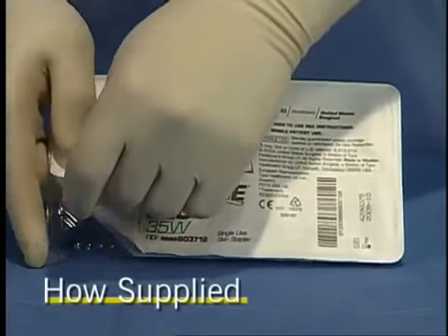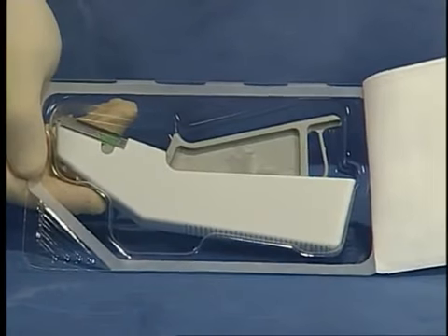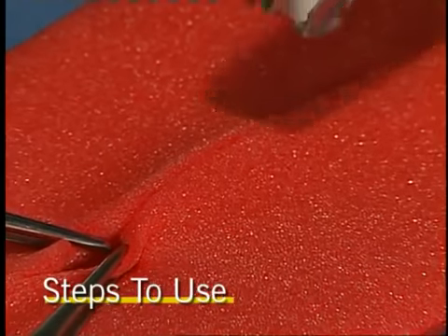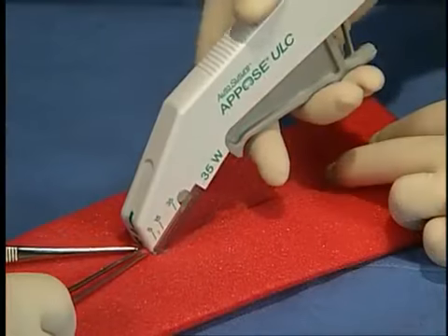The Appose ULC single-use skin staplers are shipped sterile. To use, evert the skin edges. Position the stapler over the center of the everted skin edges and squeeze the handle.